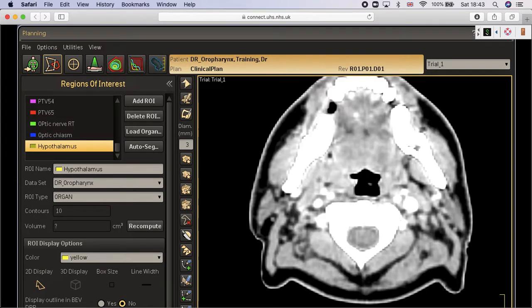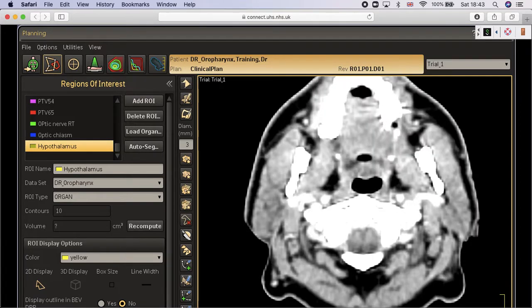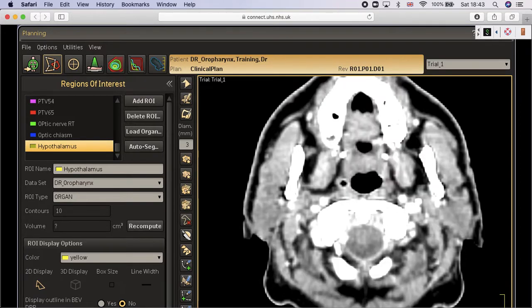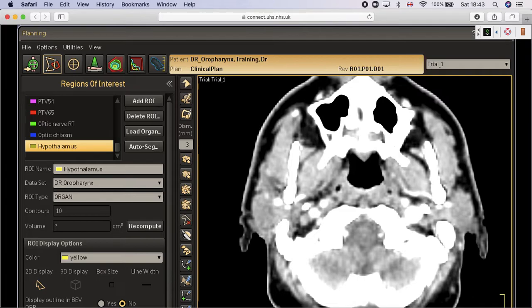The importance of the pharyngeal muscles, I think, will come very soon, and we will have to try. I'm talking to myself, by the way. We have to try to familiarize ourselves with the pharyngeal muscles, because of the new results of the DARS trial.